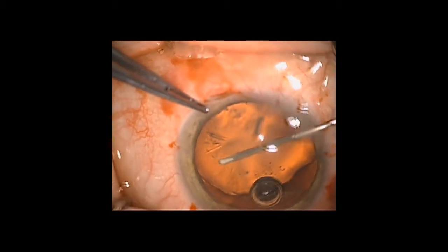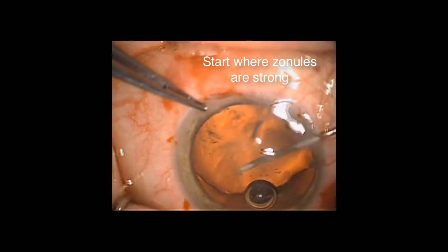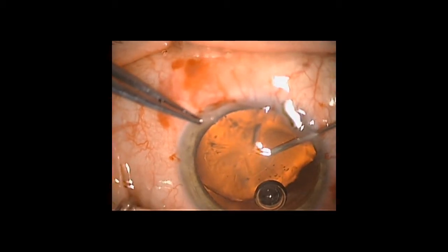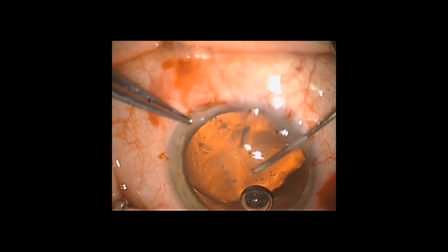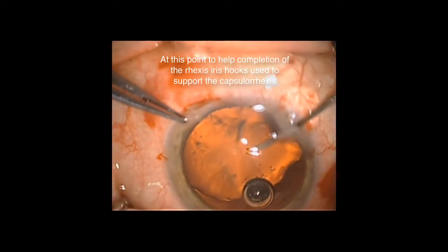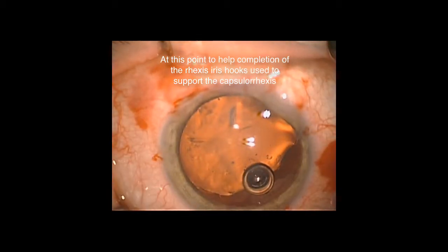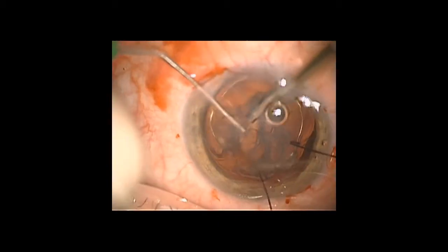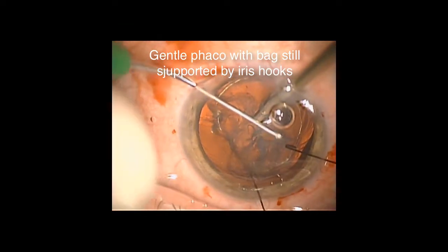Making a capsulorhexis, as in this case, it is important to commence the pull of the rhexis utilizing the strong zonules as countertraction. Always use a shearing technique as shown to reduce the forces involved rather than any form of ripping technique which increases the forces. Make the rhexis initially small. It can be enlarged later if required once the tension ring has supported the bag.